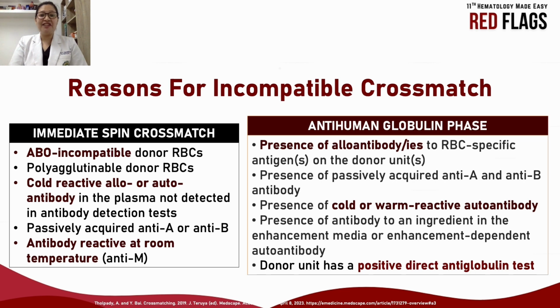Let us now identify the reasons for an incompatible crossmatch. If agglutination occurs during the immediate spin phase, one of the following situations may have occurred.